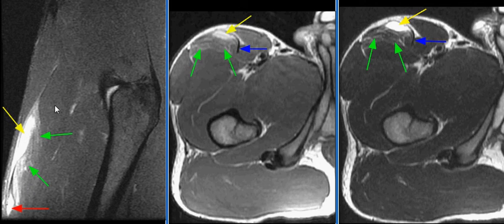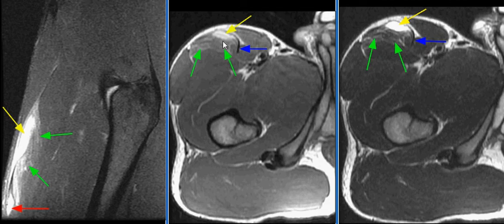Of the rectus femoris muscle, there is a partial intersubstance tear of the direct head tendon at its interface with the anterior fascia of the mid thigh. Two intramuscular hematomas are seen. The most proximal hematoma is anteriorly within the muscle belly.